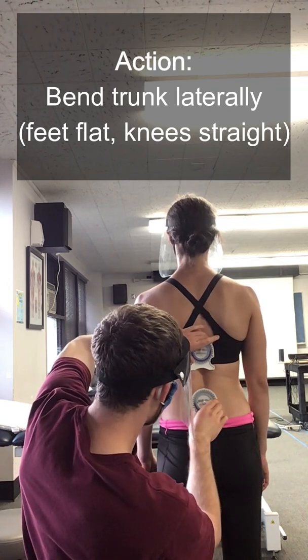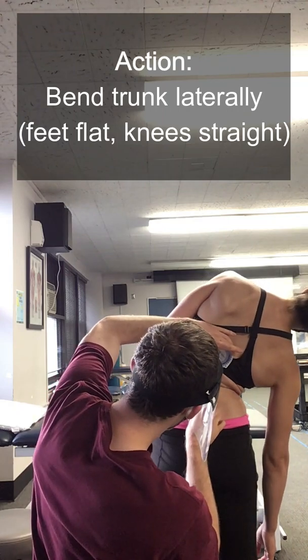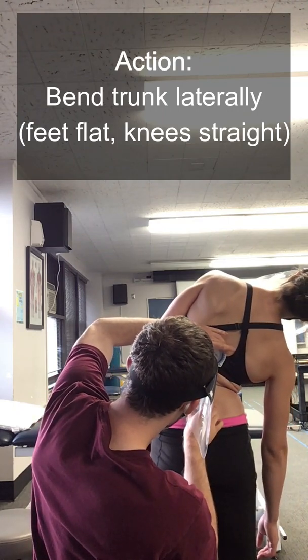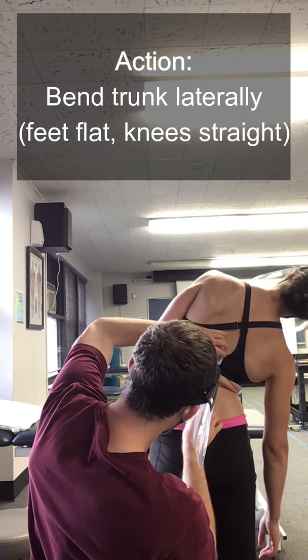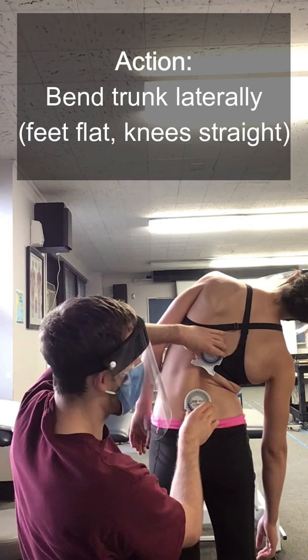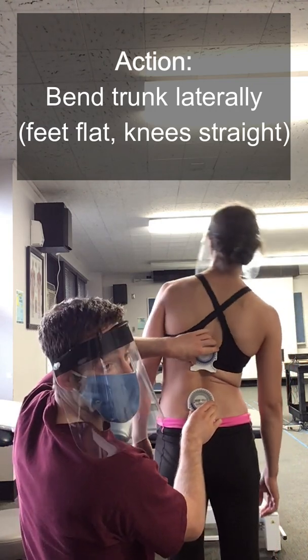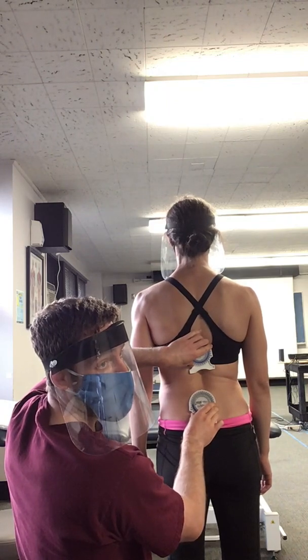Jenna, I'm going to have you bend to your right. And right there, I'm keeping it in line with the spinous processes. The top is 35 and the bottom is five. So you can come back to the start. I'm just going to subtract those two — 35 minus five — so we got 30 degrees of lateral flexion to the right.